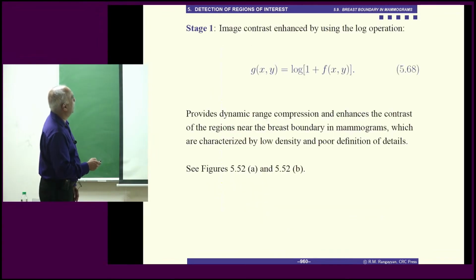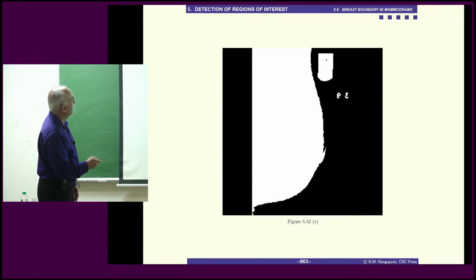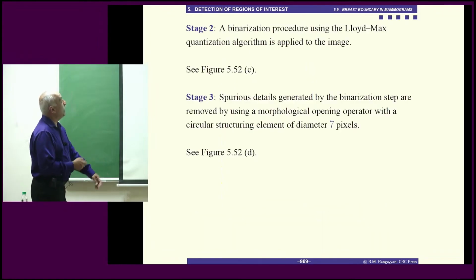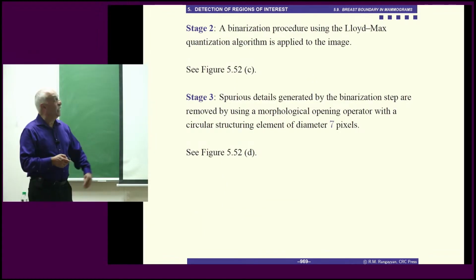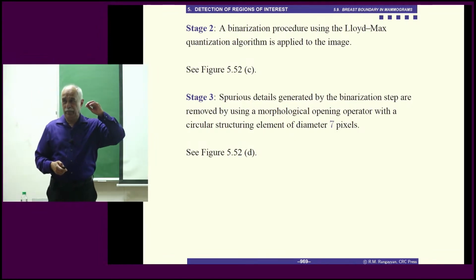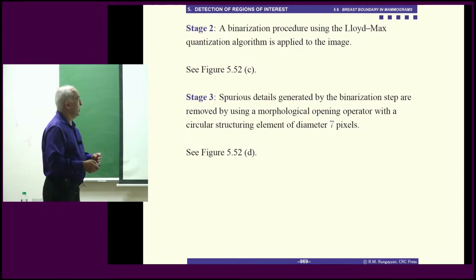So let me go back to this stage 1. Okay, let me go and find stage 2. Where is that? Stage 2. A binarization procedure is applied using the Lloyd-Max quantization method that I described earlier, right at the beginning. You could use any quantization technique.